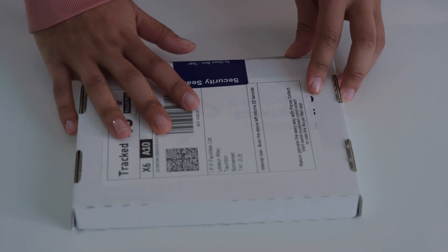Post your sample in any Royal Mail post box. To recap, to make the test easier, try these top tips.